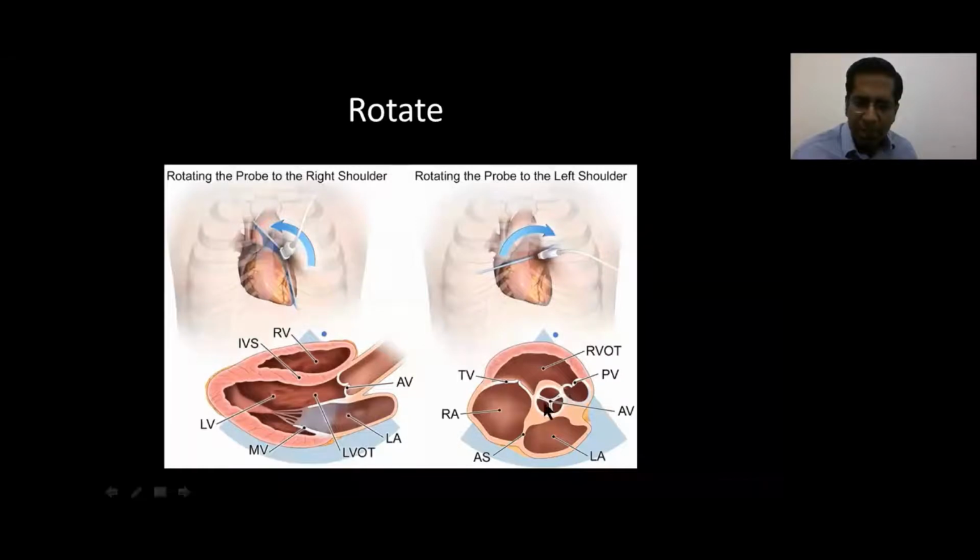You see the aortic valve here in the center, the tricuspid valve, and the interatrial septum. This is a very nice, important view for the interatrial septum. When there is a doubt about foramen ovale or even ASD, this would be an important view to look at. This would be your aortic rim here in case of an ASD, and this would be your posterior rim in case of an ASD. What you see here is the left atrium, and you would also be able to see the left atrial appendage here many a time. Sometimes you can also see a red flow coming here; that would be the left-sided pulmonary veins coming into the left atrium.